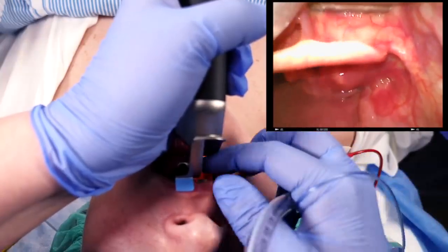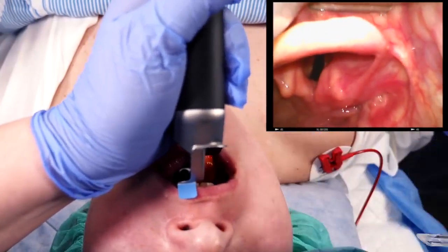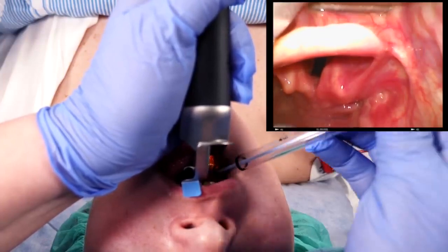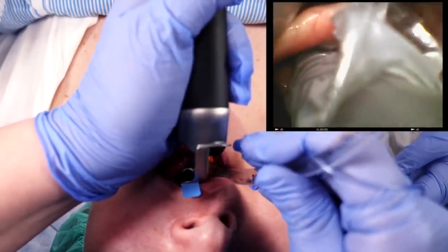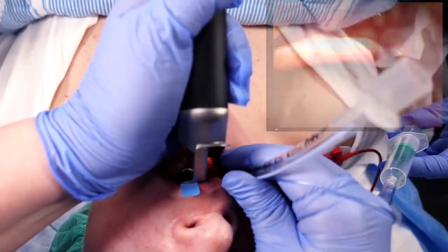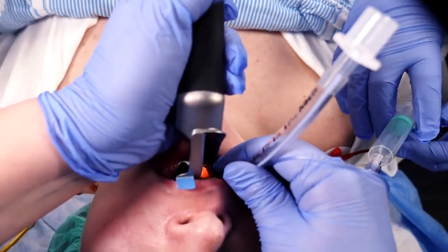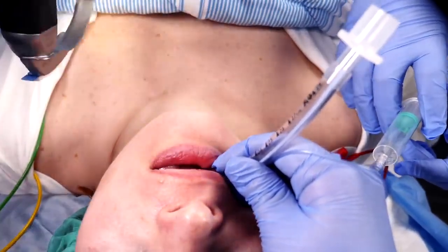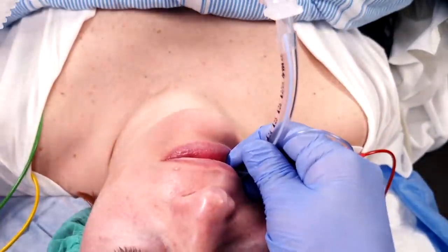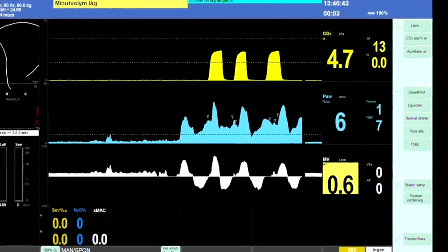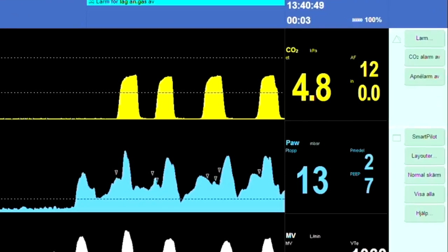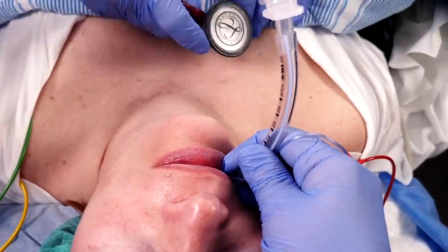By now you hopefully have a clear view of the opening of the trachea — a dark slit between the pale vocal cords. Insert the tube carefully. Sometimes a gentle rotation is required to pass the vocal cords. Advance the tip until the cuff has disappeared and the vocal cords are between the two black lines. Ask for inflation of the cuff and carefully retract the laryngoscope. Hold the tube firmly while you confirm that it's lodged in the trachea and not the esophagus. The gold standard is return of end-tidal carbon dioxide over several respiratory cycles.